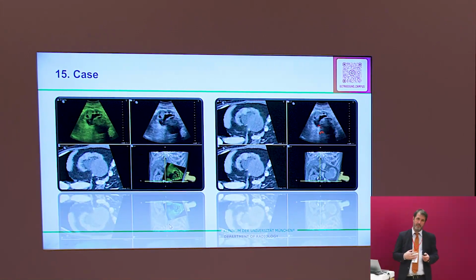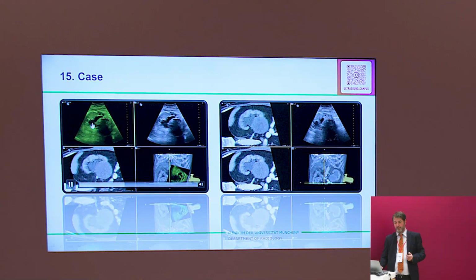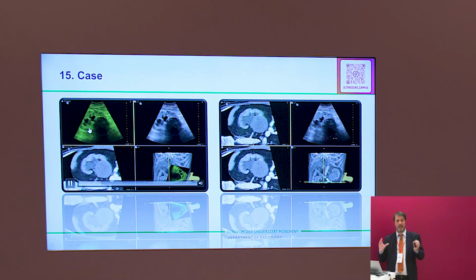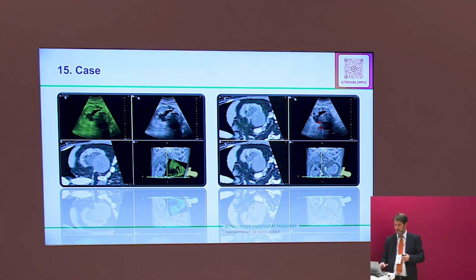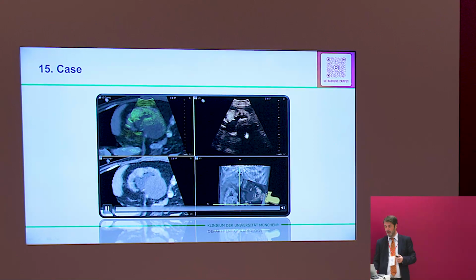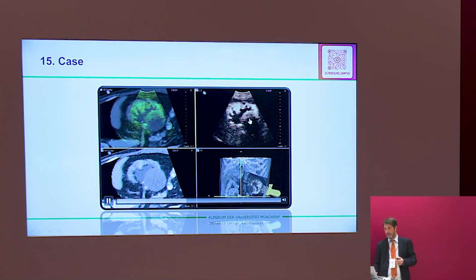If you look very carefully and if you have experience, you see the patient still has a hydronephrosis inside, so the collecting system is enlarged. Something compressed it. Color Doppler could not see a flow. So we inject contrast. There's our lesion. And look at this area. Is there uptake or not?